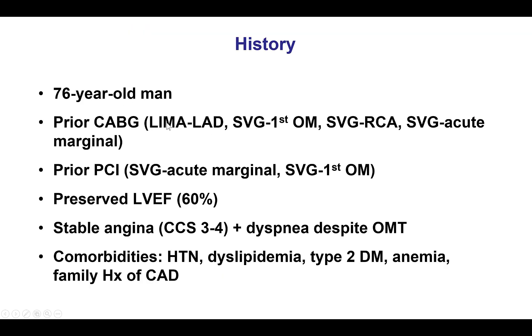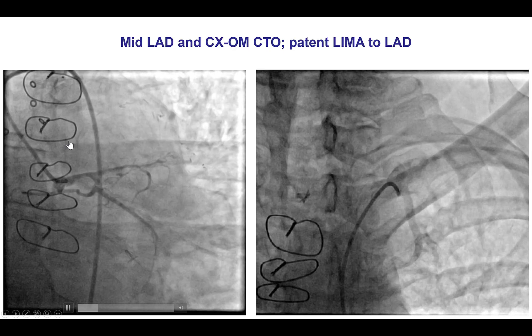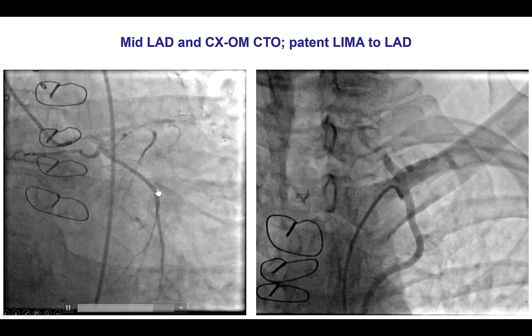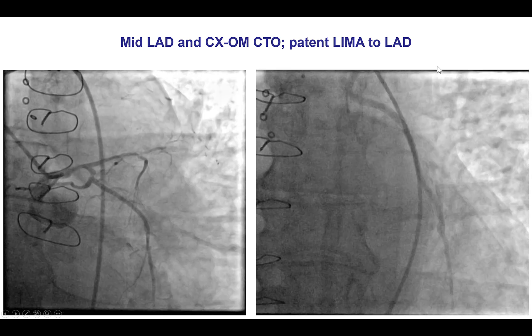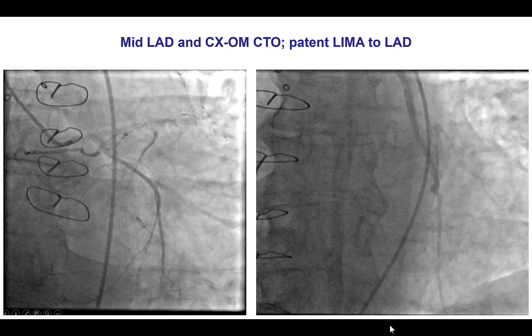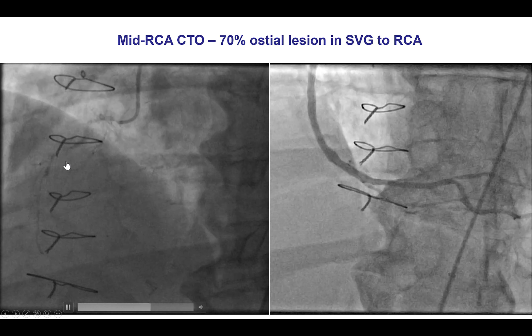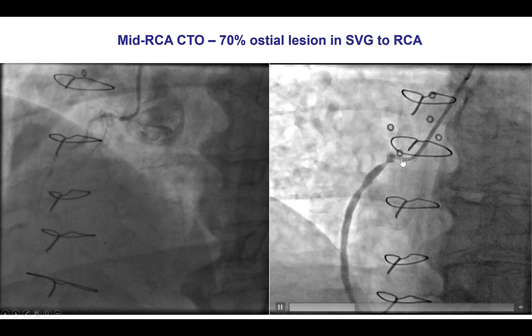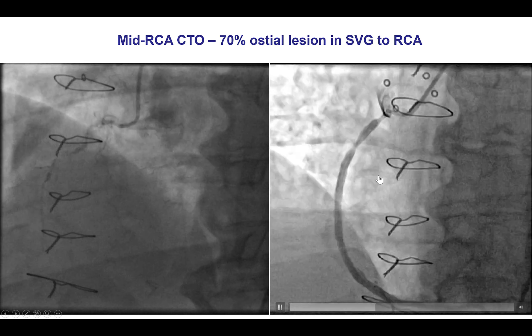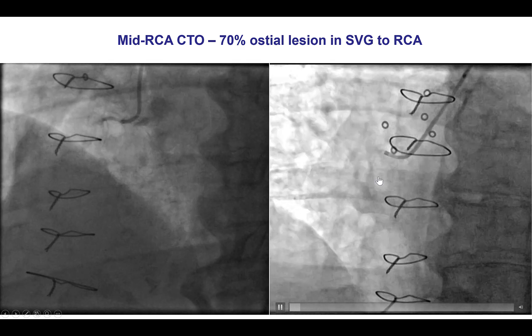The patient had previous coronary bypass with a LIMA to LAD and three saphenous vein grafts. He had already undergone PCI in two of those three SVGs and presented with angina. Diagnostic angiography demonstrated CTO of the mid-LAD as well as CTO of the obtuse marginal branch. There was a patent LIMA to LAD graft supplying the mid-LAD. There was also a CTO of the mid-right coronary artery with heavy calcification, with the distal RCA filling through a saphenous vein graft that had an ostial lesion, which was considered to be the culprit for the patient's presentation.